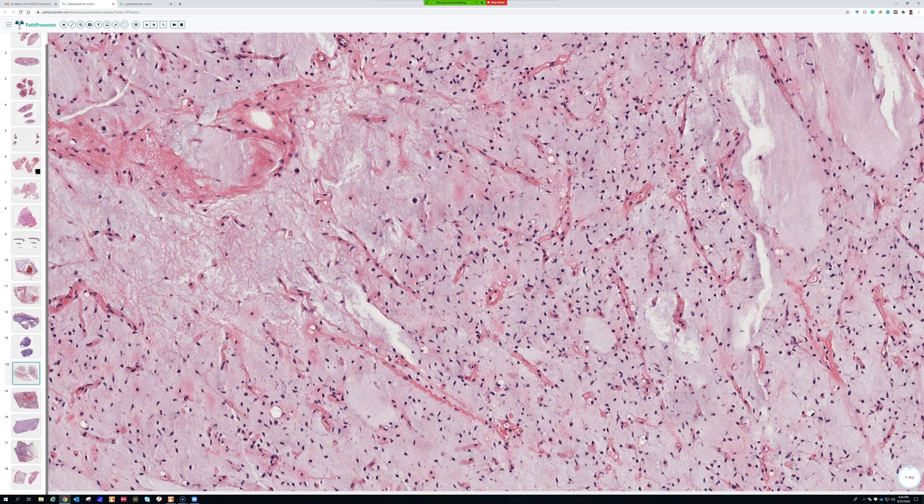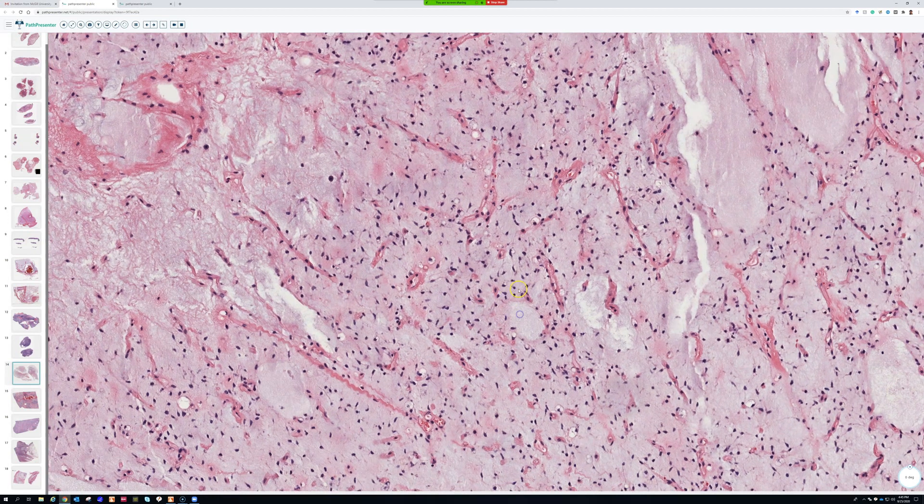They do not form cords and chains. So unlike some of the other myxoid tumors we talked about which have cords and chains and connected cells, you don't see connected cells in regular conventional myxoid liposarcoma. You see these little cells that are spread out.